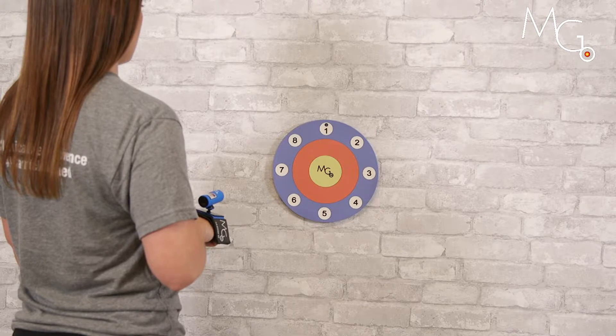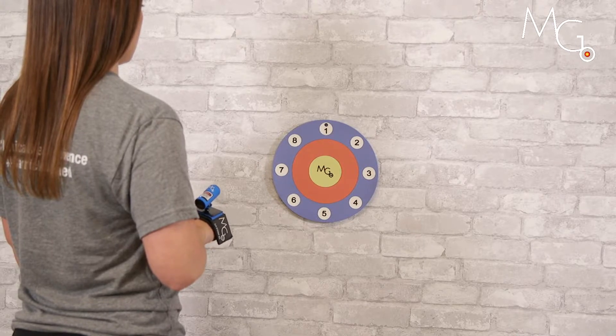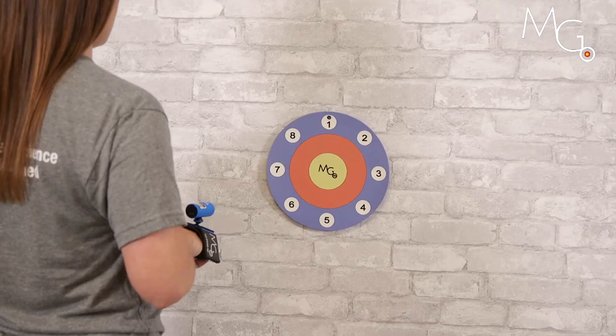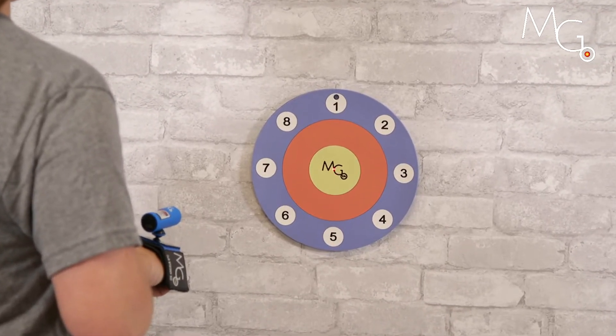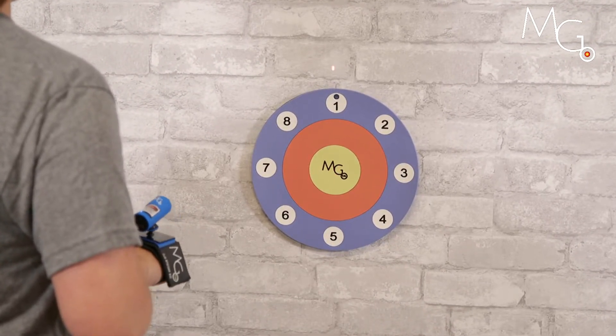I'm going to turn the laser off, come back up, and then come back down. So you're a little bit below the target. Re-center that for me. Now bring the laser up above the whole target.